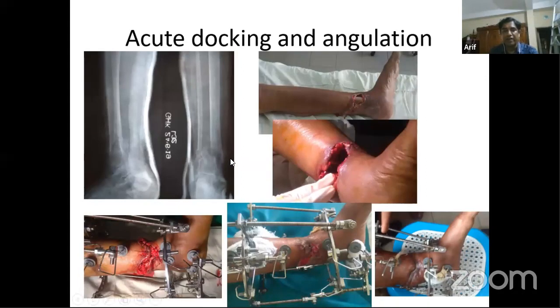This 65-year-old patient with very porotic bones had a very bad fracture. You know that they were exposed, dirty with mud and other things. I just cut the bone which is bad, devitalized and very much contaminated. For this old lady with this type of socioeconomic condition and hospital stay, you have to do things just one time. Your chance is one time.